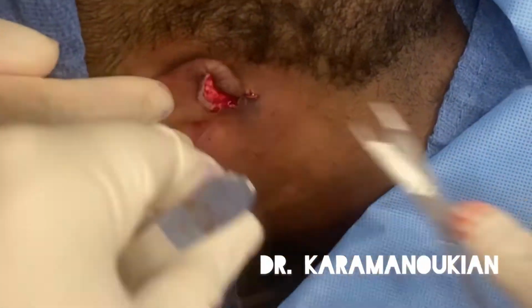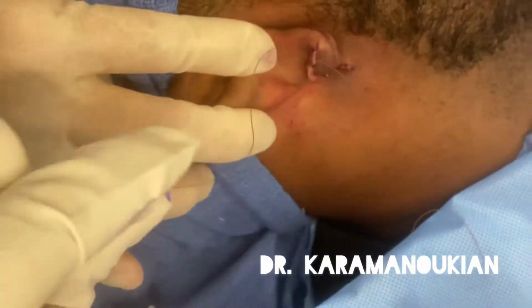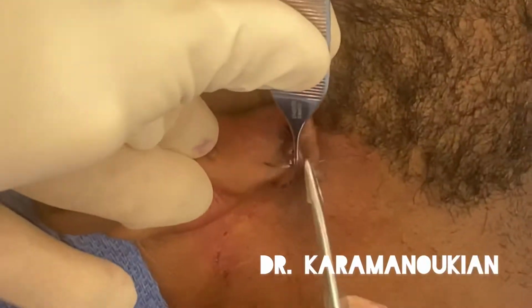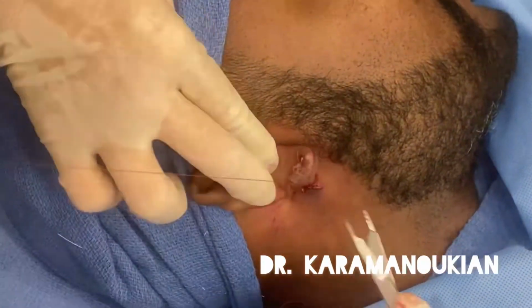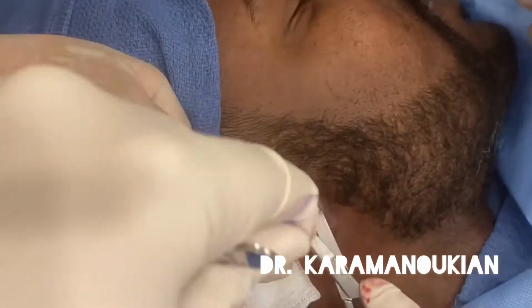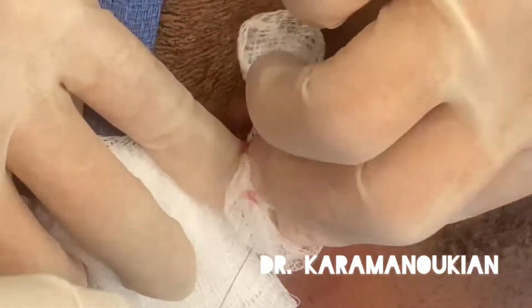The last important step is to reconstruct the ear so that he doesn't have a large aesthetic deformity after surgery. The earlobe is a very, very important aesthetic unit of the face, and we want to preserve the integrity of the contour of the earlobe so that it can look like the other ear. I'm using interrupted sutures, which have a lower likelihood of breaking down after surgery and during the recovery period. And these are being completed one by one. And in a minute or so, you'll see the final result, which is an earlobe that looks relatively normal.